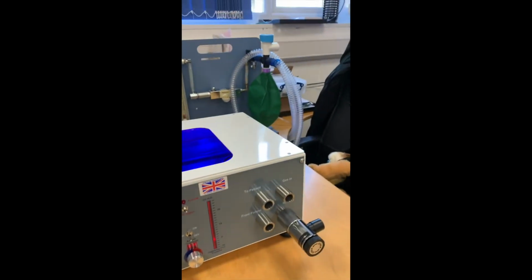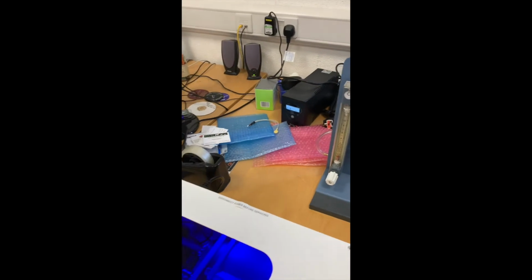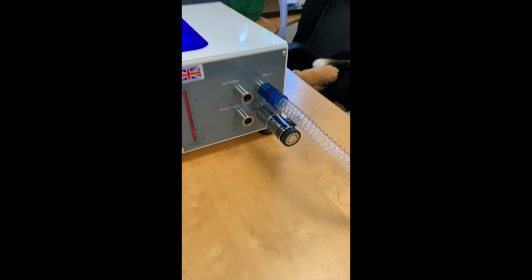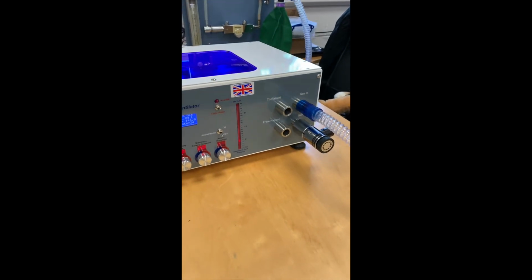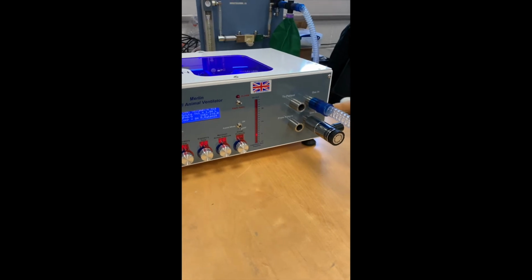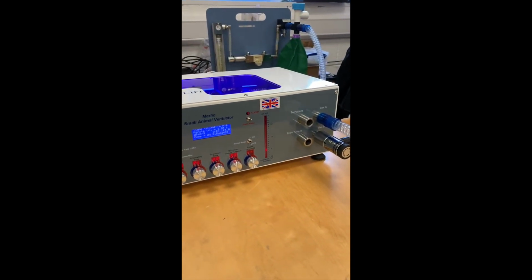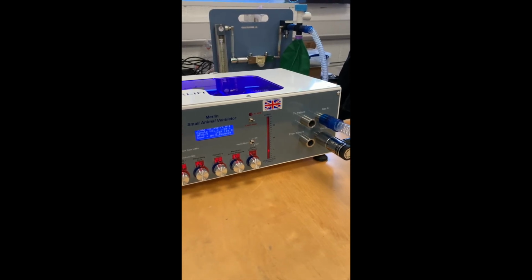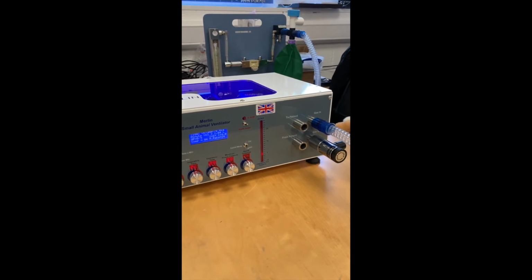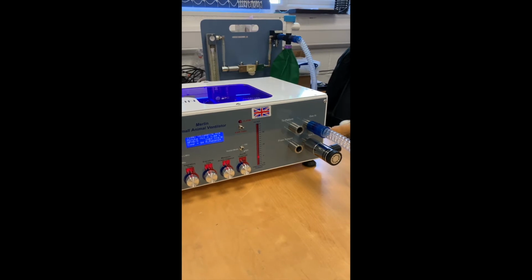Gas from the anaesthetic machine over here is delivered to Merlin at low pressure into the gas in port. Merlin doesn't control the gas input, it simply expects gas at low pressure when it wants to fill the piston again. So this is not the traditional input from a high pressure 60 psi 4-bar oxygen outlet. This is coming from a low pressure, typically from an anaesthesia machine or from a flow meter outlet.